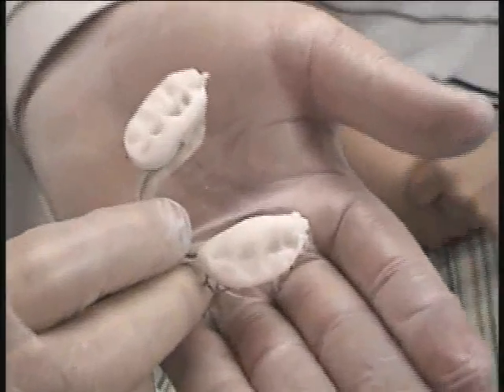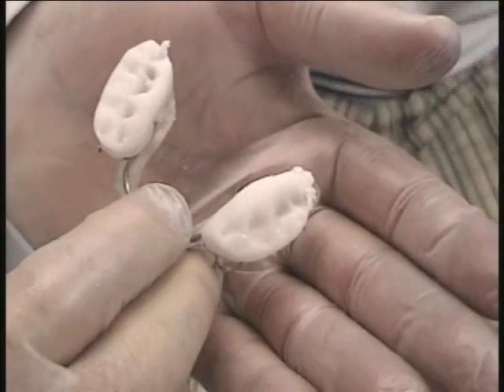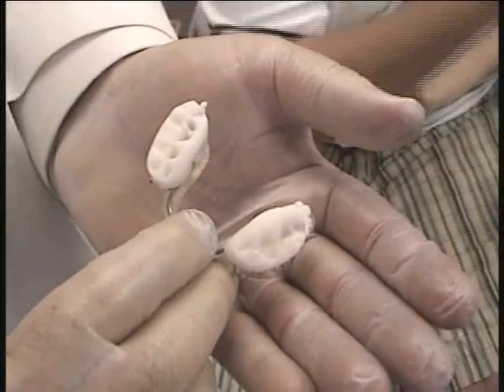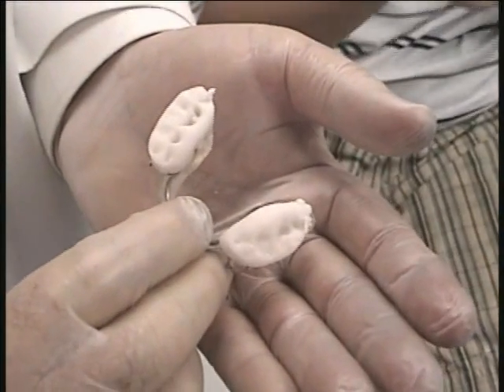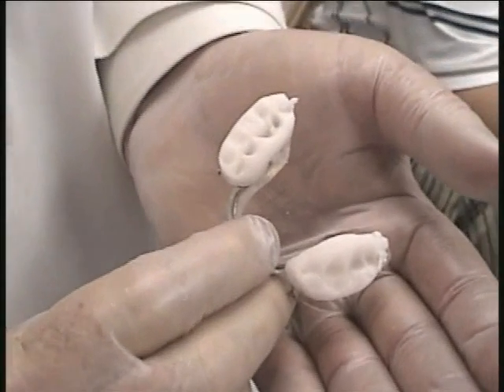I've added some additional acrylic here, the amount being the thickness of those three additional tongue blades. Now I'm going to let the acrylic harden and trim it to the thickness of those three tongue blades.